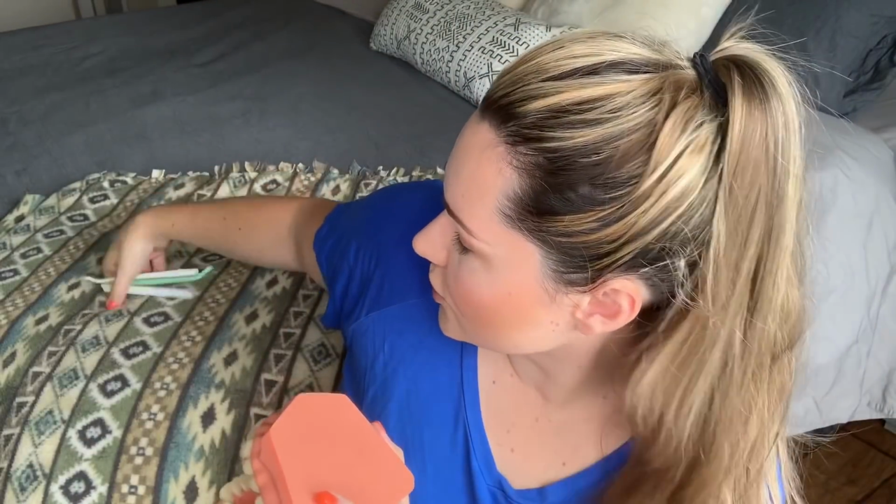Oh, one more thing. During an extraction, if it's just a normal extraction and that means they're not using a handpiece, they're just using forceps, you'll use your extraction suction. But if it moves to surgical, which means they're gonna use a handpiece to section the tooth or cut it in half to make it easier for extraction, you'll use your HVE again, because as soon as there's water being used with a handpiece, you'll want this because it will suck out more of the water. If you just had this in there, it's not gonna do a lot of suction, okay? They're gonna be filling up with bloody water, and that's not what you want. So you wanna swap back to this if they're using a surgical handpiece to section a tooth.